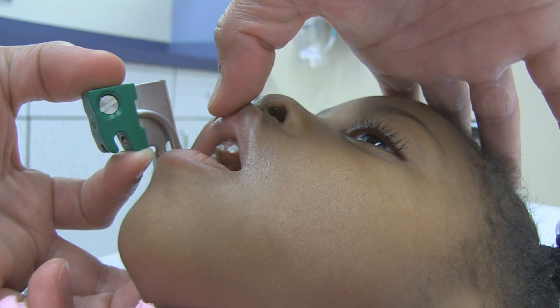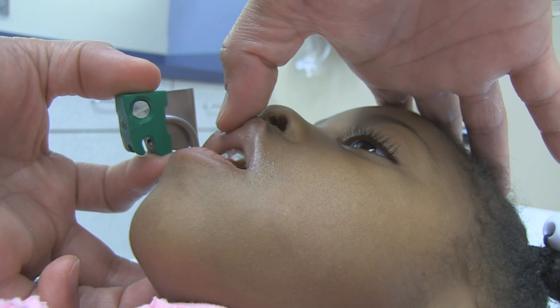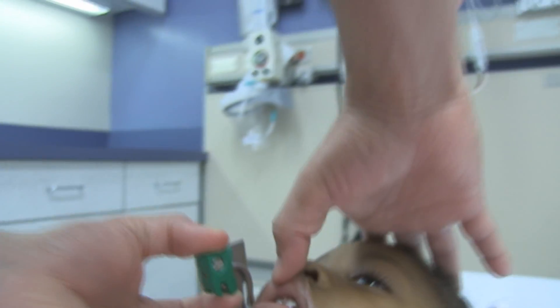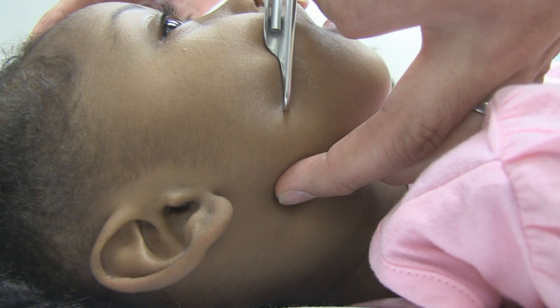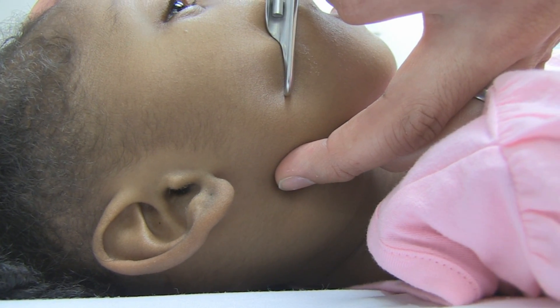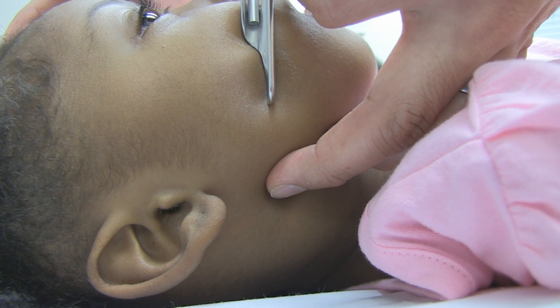Bring the insertion block up just a little bit — there we go, I think that lines up right there. And the angle of the mandible is right where your finger is. So this blade is actually maybe a little bit too short — maybe way too short. The Miller 1 is likely the correct choice for this child.